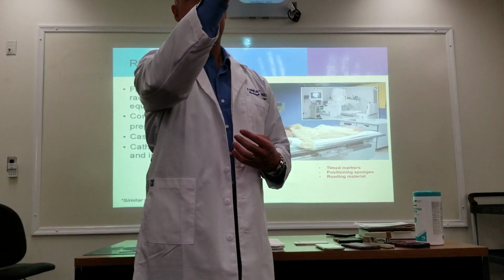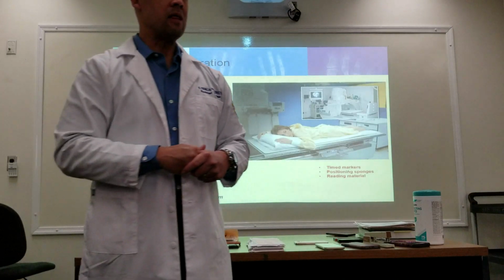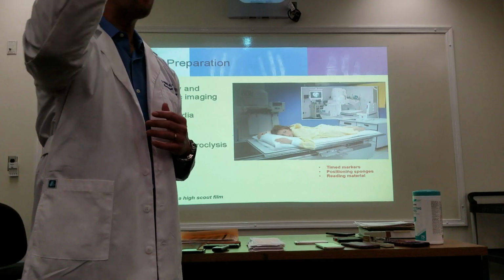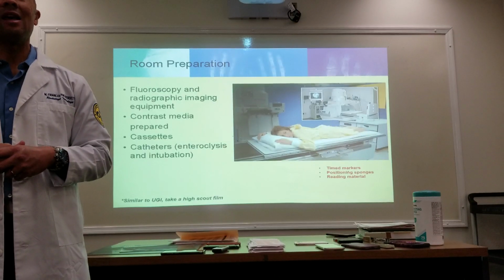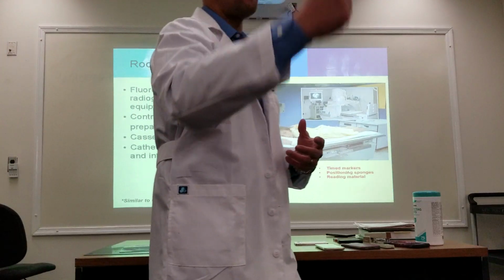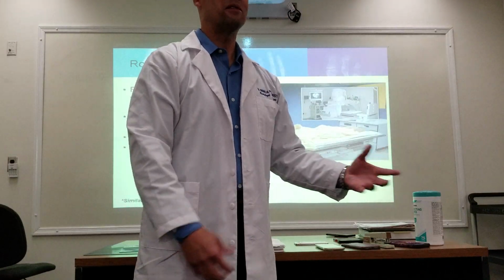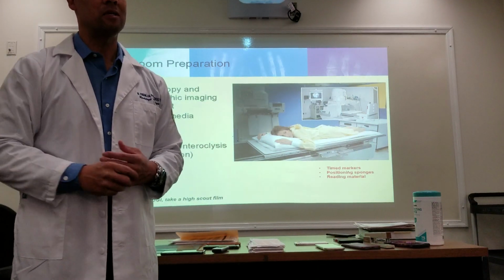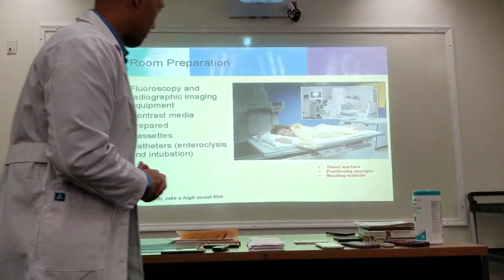Young, weren't you talking about a barium enema the other day? Young was saying that in their department they did the fluoro part of it, and then they did their overheads. Now, how many overheads do you have to do for a barium enema? Like 5. We did 9. That was a lot, while the patient had a tube up their butt. She was very uncomfortable. Yeah, it's a very uncomfortable procedure. So you guys did 5. We used to do 9. And I also asked that of Mr. Benoit, and he said, no, we never did overheads for barium enema. So again, it differs from hospital to hospital. All right, so the doctor comes in and does the procedure, and now this is where we are.